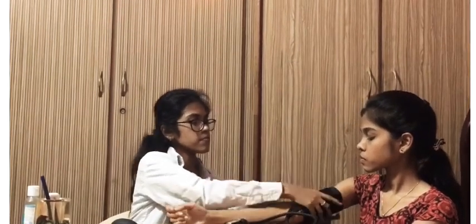Slowly deflate the air. While deflating the air, at a point in time you will hear the first Korotkoff sound, and that is the systolic blood pressure. The sound goes on continuing, and at one point it becomes dull. That point is called the diastolic blood pressure. So the systolic and diastolic blood pressure of my patient is 118/78. Thank you.